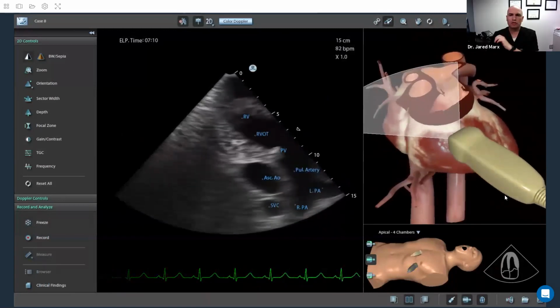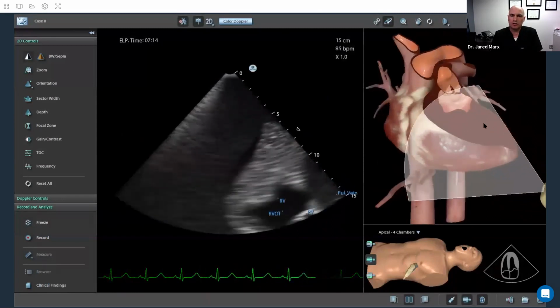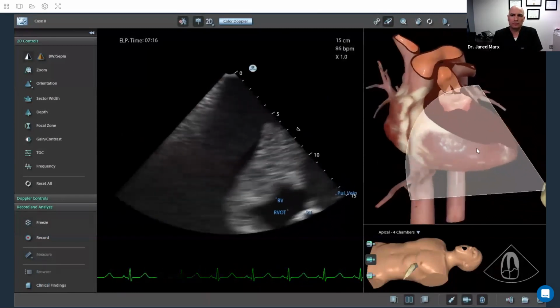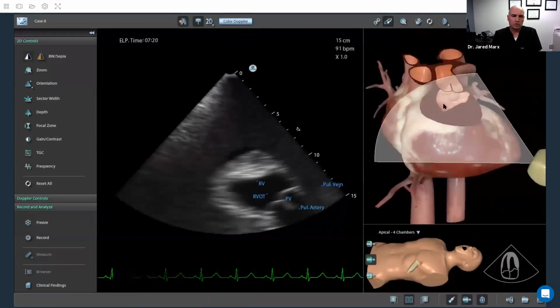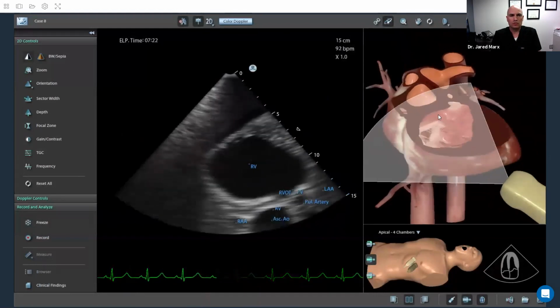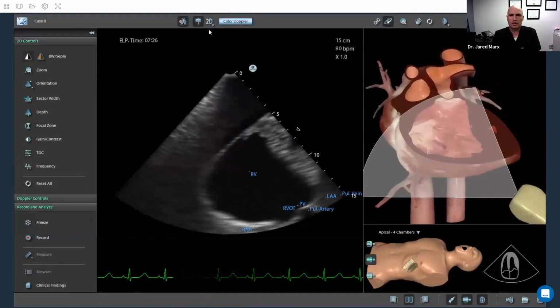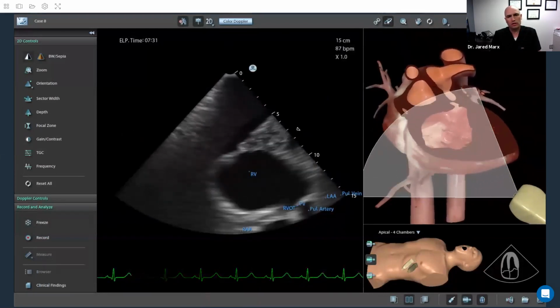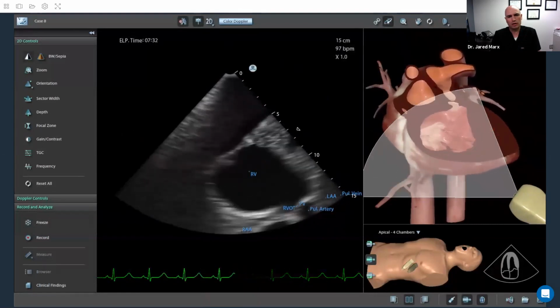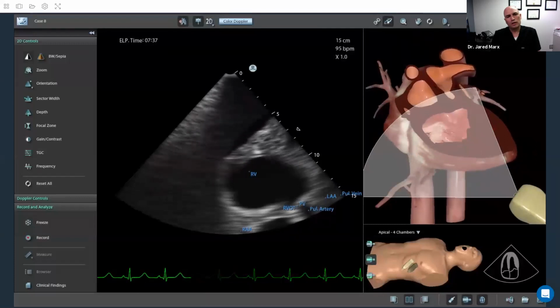For us, I think so. We do a lot of practice scanning in our department, where our residents go introduce themselves and say, you've had this study done, I would like to perform the same study. And if they've had a similar study, like maybe a CT of the abdomen, then they say, I want to look at your gallbladder. Then they compare the images, and that's how we prevent safety issues with our training.